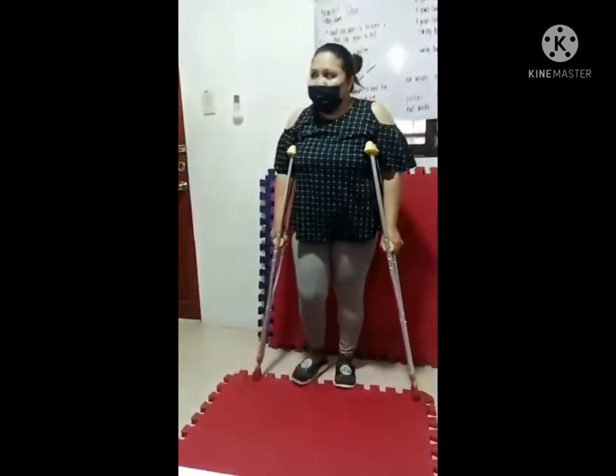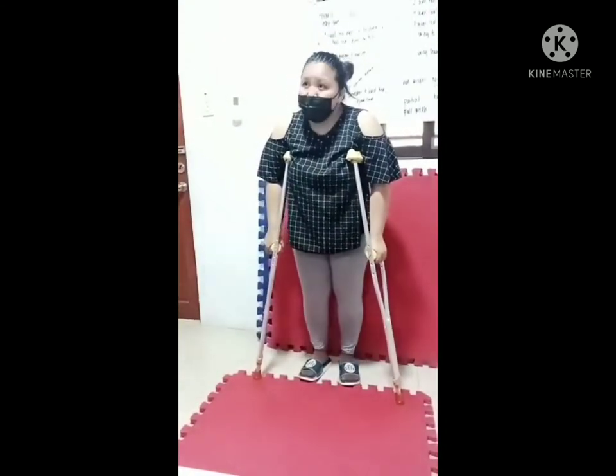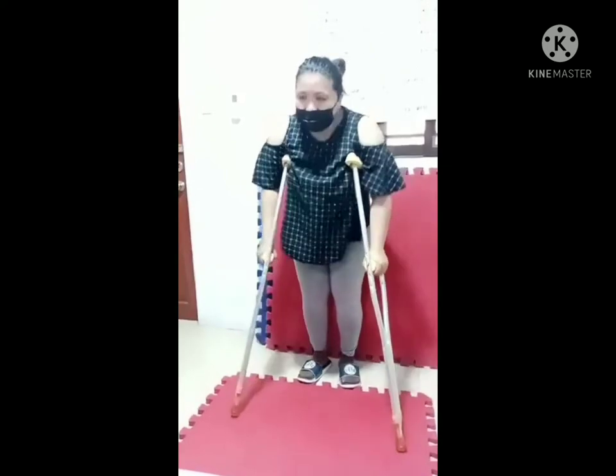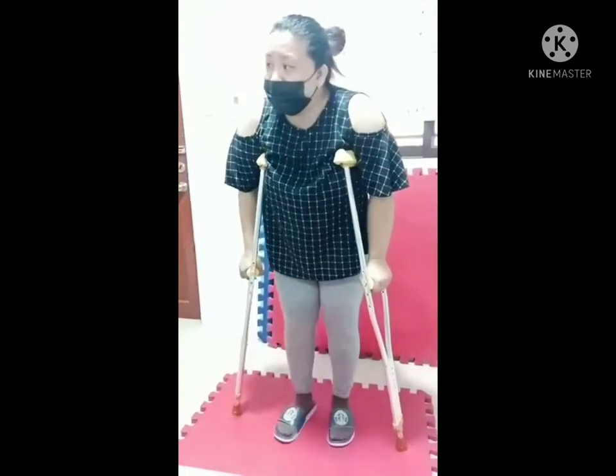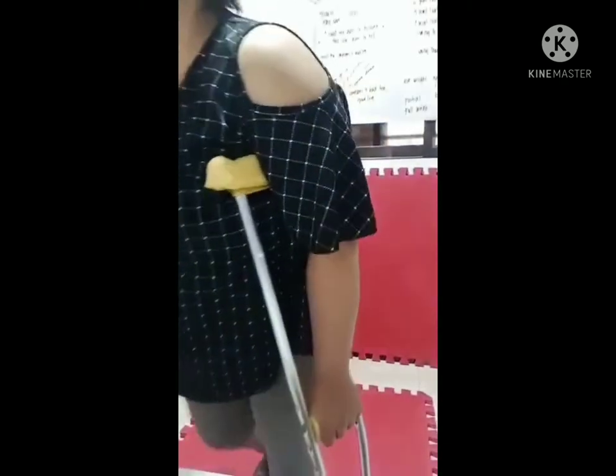For a unilateral weakness, we use the three-point gait: crutches, bad leg, good leg. Crutches, bad leg, good leg. One, two, three.